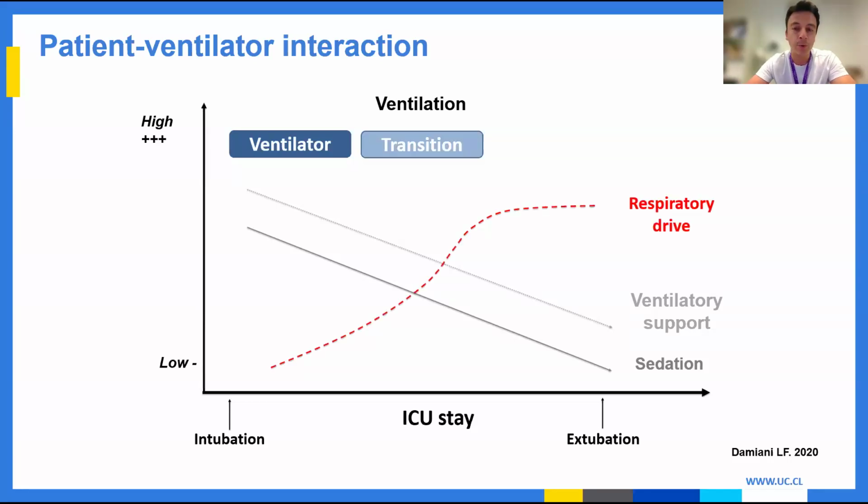We now begin a transition phase when the respiratory drive of the patient is getting back to normal values, and both the mechanical ventilator and the patient are trying to control the ventilation. Then, when we are almost ready to extubate our patient, in a more assisted and spontaneous phase, it is mostly the patient who is controlling the ventilation.